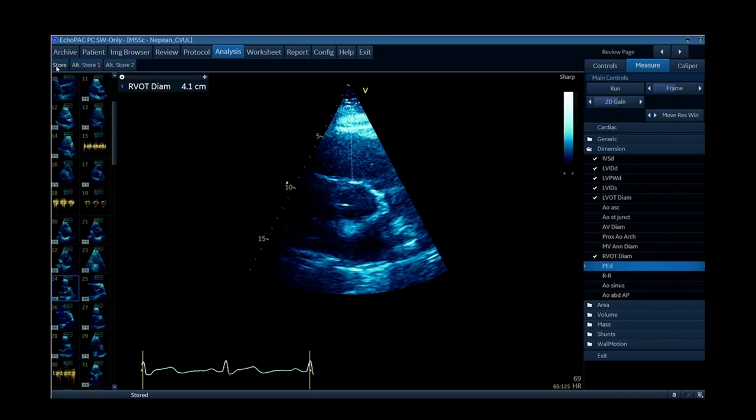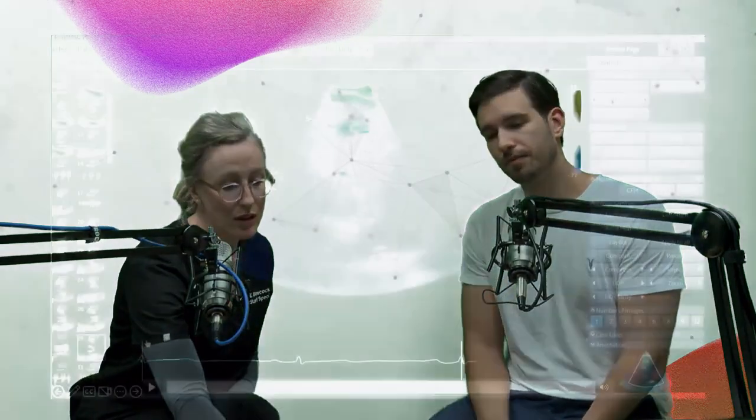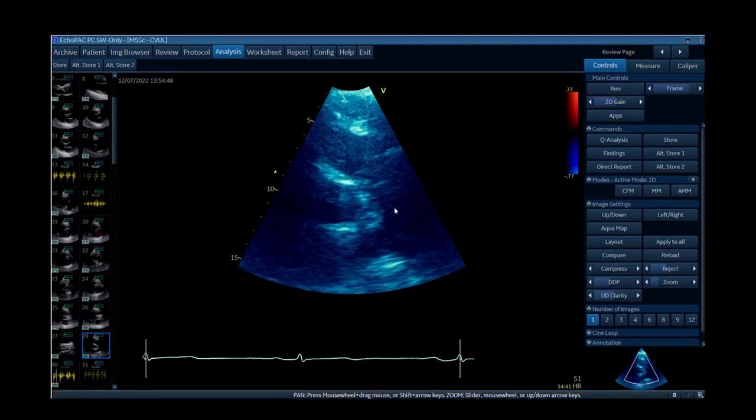The upper limit for the distal RVOT is around 27 millimetres. So to summarise: proximal RVOT 35 mm, distal RVOT 27 mm. This patient has a dilated RVOT in a couple of views. There are certain conditions where specific dilatation of the outflow tract is really important — for example in arrhythmogenic right ventricular cardiomyopathy, RVOT dilatation can be the only feature, and these patients often need cardiac MRI.